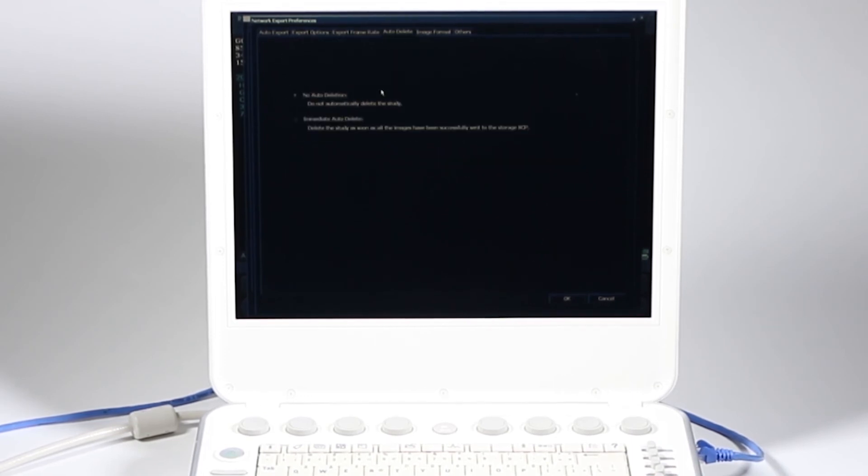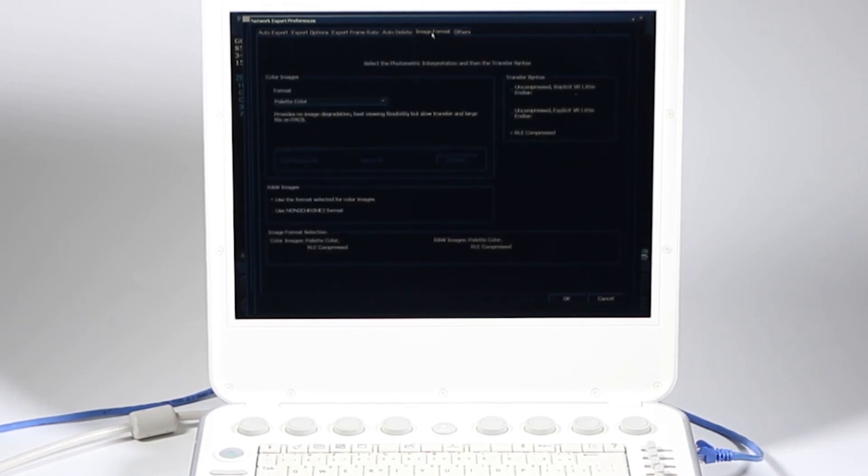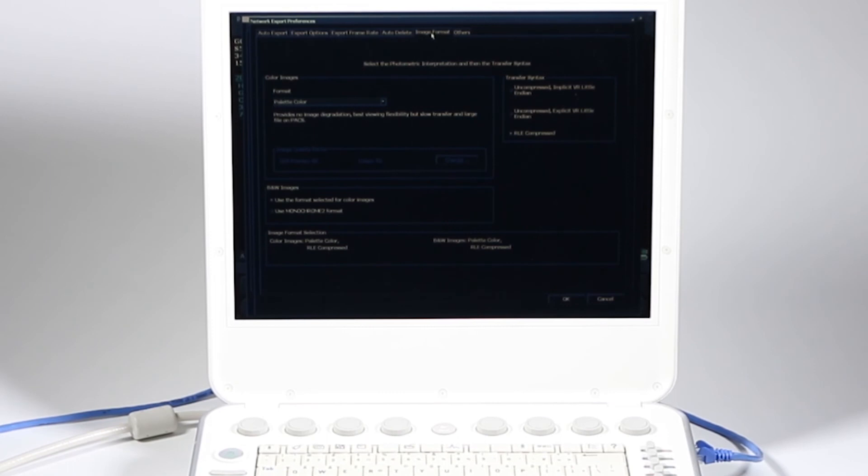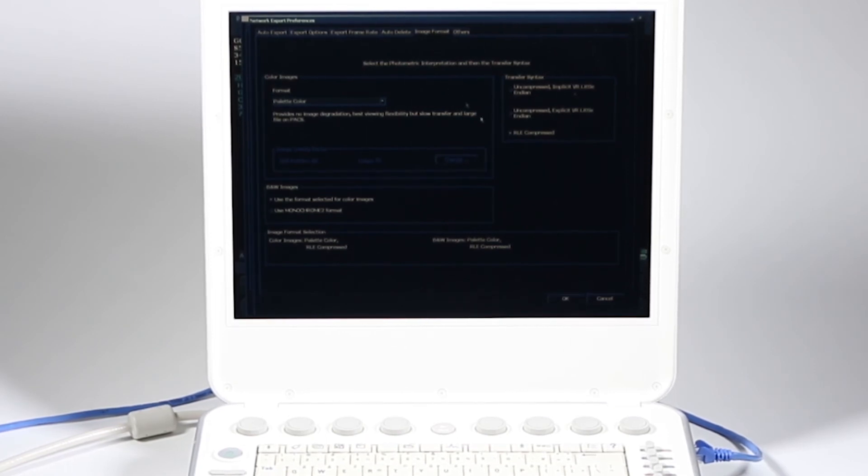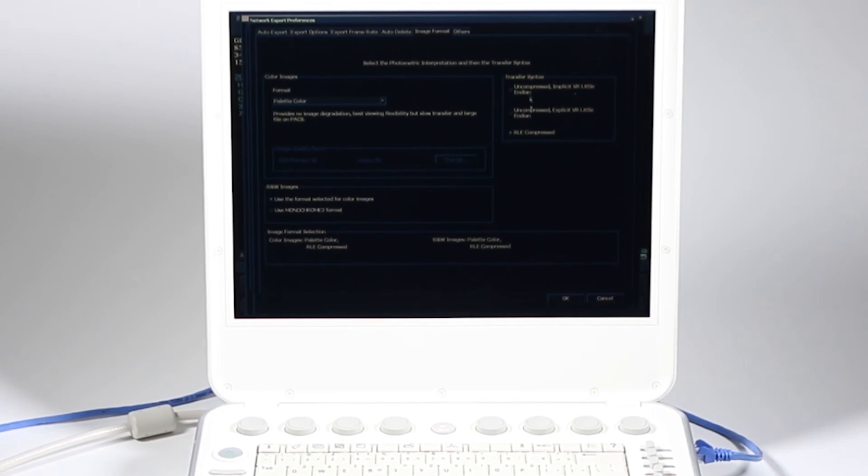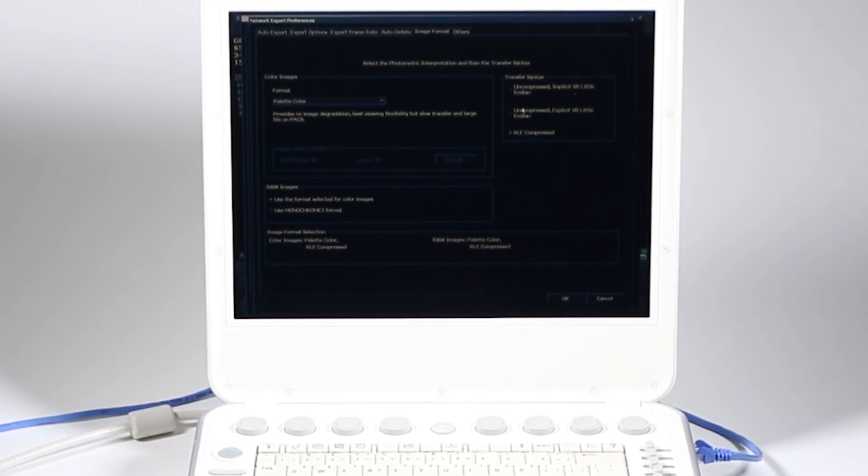Auto delete, you want to delete the study after it's sent. Image format, this is also very important and very confusing. This is saying it's going to use compressed, these transfer syntax, uncompressed. Chances are you don't want uncompressed. Those are huge file sizes and it's going to be slow to transport.